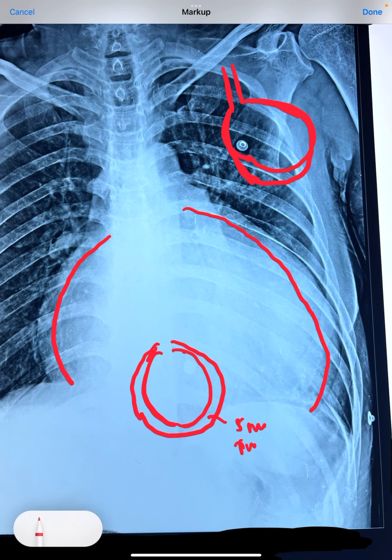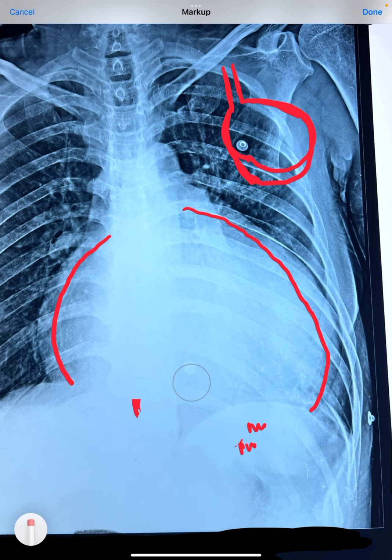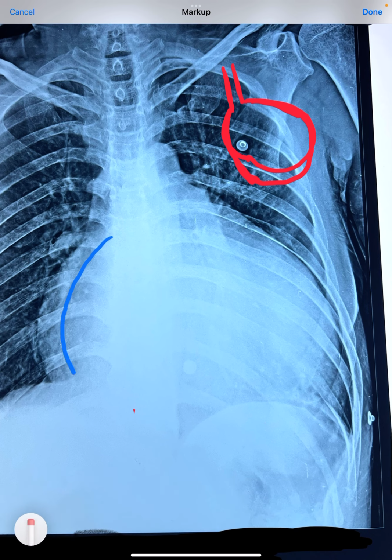This huge pericardial effusion will line up the heart, and it will have a globular contour just like this balloon. That is the reason why on the right, left, above, and laterally, everywhere you'll be able to see this globular contour, because of the accumulation of the pericardial fluid around the heart.